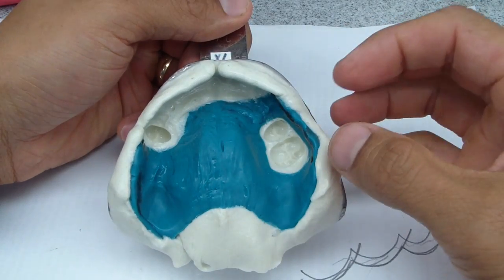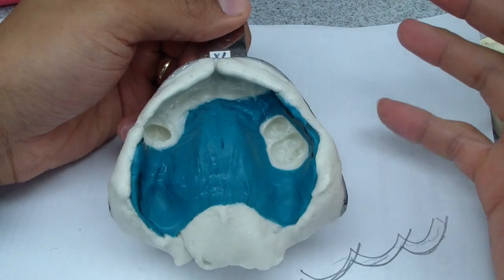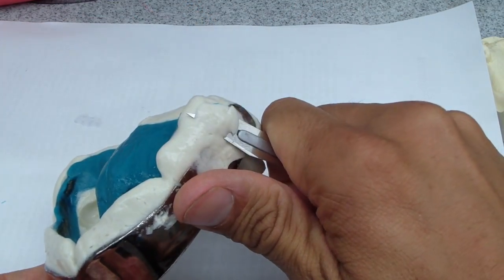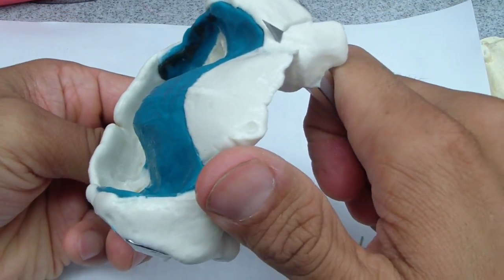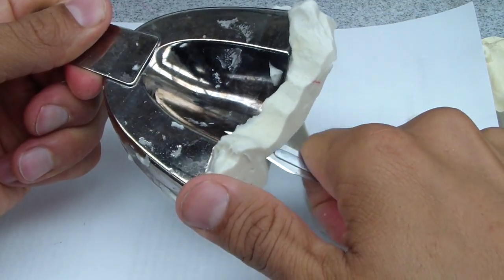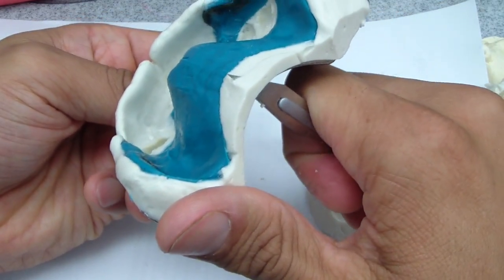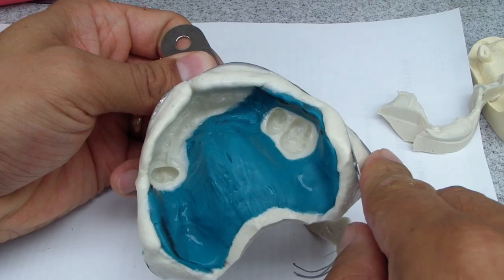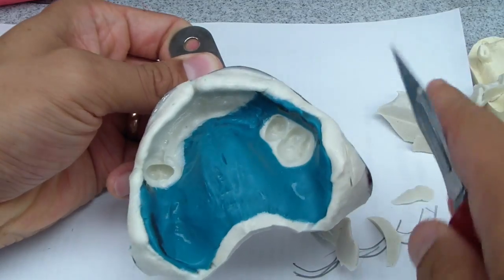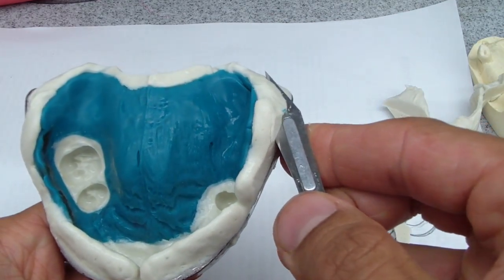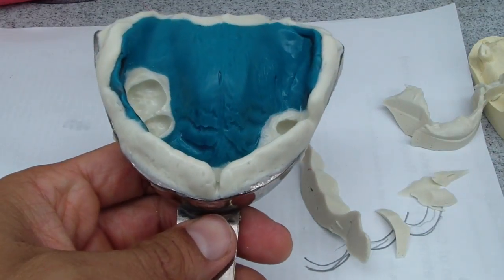Okay, so here we are. Now we've picked up the custom tray and polyvinyl siloxane impression. This is called a sectional impression technique with an alginate impression in a stock tray. So we're just going to trim back approximately two millimeters. It's on the posterior segment because we don't want any overhang in the posterior, but this is going to act as our land area, as Dr. Dre just mentioned to me. Okay, there we go. And that should suffice.